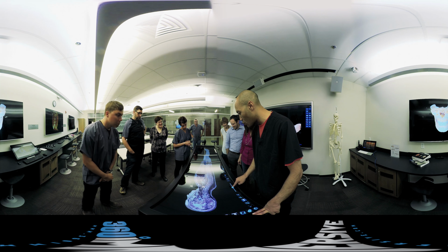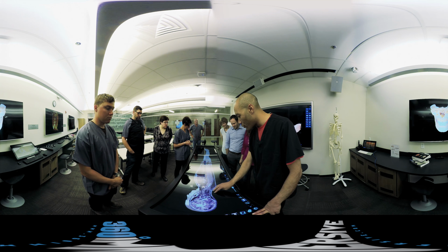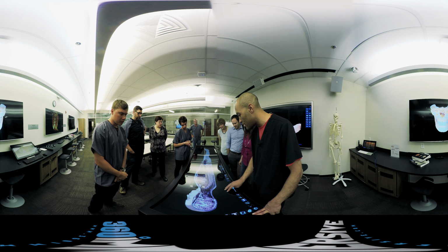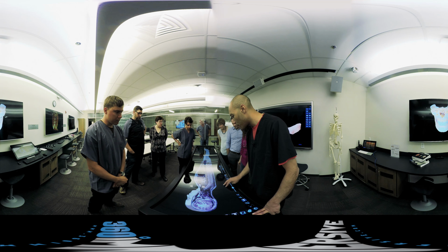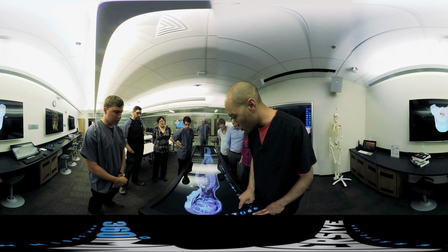But maybe I want to show off something, for example, I want to really highlight some of the structures of the vertebral column. With 3 fingers, I can scroll through a little bit more gently and kind of really look for the fine detail that I want. Here we can see the spinal cord, we can see the vertebral column. That's kind of cool. The other things that are really powerful here, let's just get a straight lateral view here.